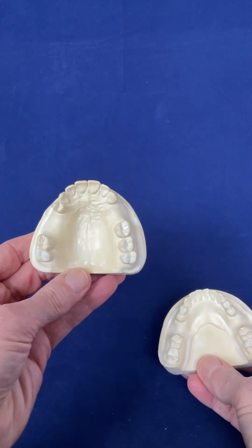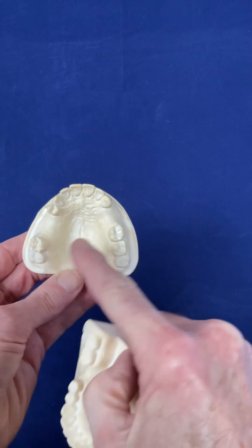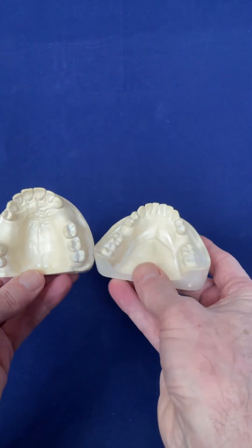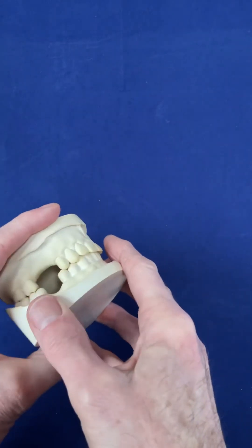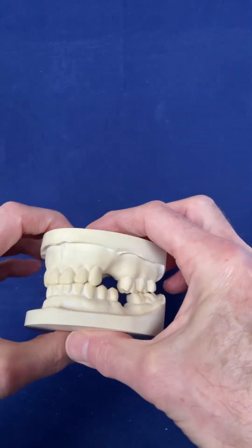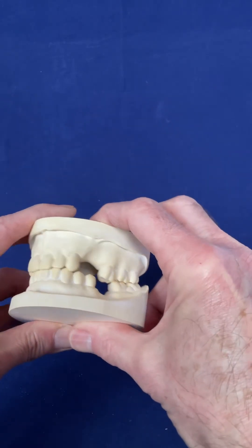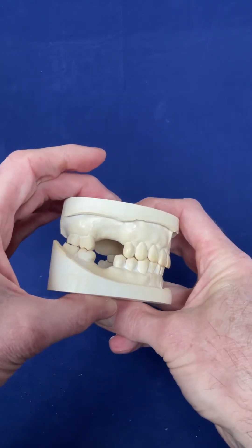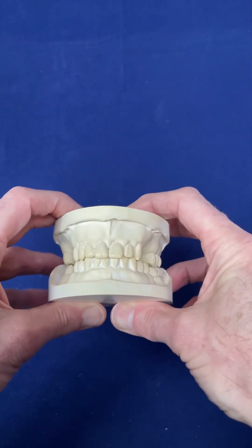In this first case, the patient has what is known as tripod contact — they have anterior and posterior teeth in both arches. If the patient closes together, you can put the teeth together and see them intercuspate. That is a reproducible jaw relationship.